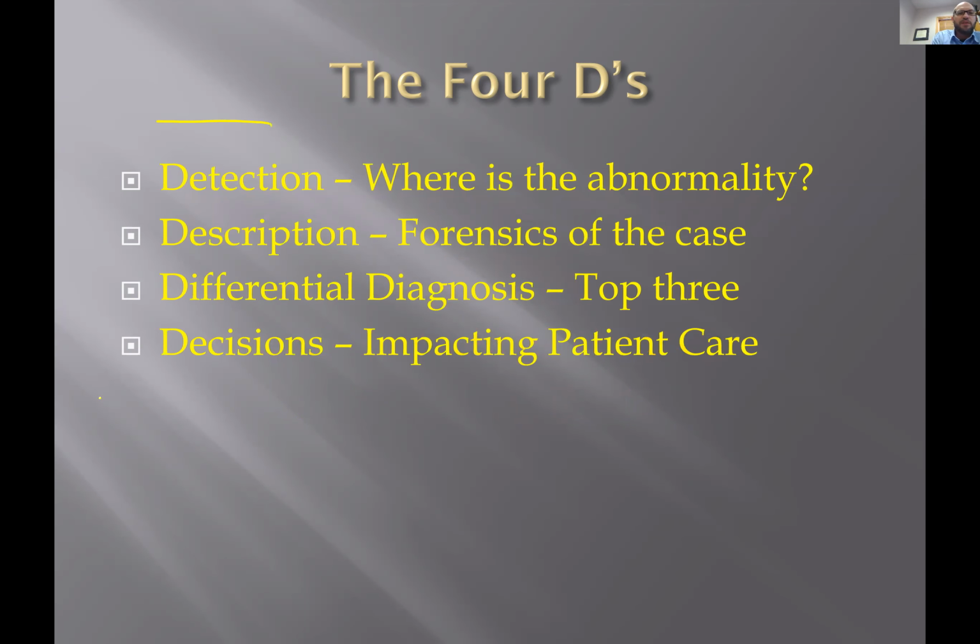We're going to be doing the 4 Ds, so we'll have questions about where the abnormality is. This is not just me speaking to you, but you speaking to me. You're interacting, doing radiology, describing it, coming up with the differential, and maybe even discussing how in the world this changes anything come Monday morning. So don't forget the 4 Ds. This is how I teach at Northwestern, and I found that this is really how it works in practice. So here we go. Let's get to some cases.